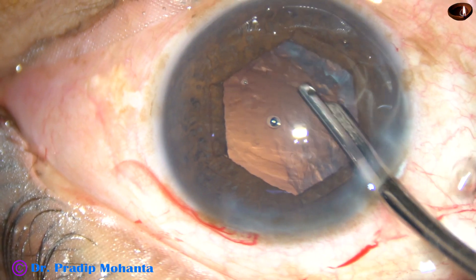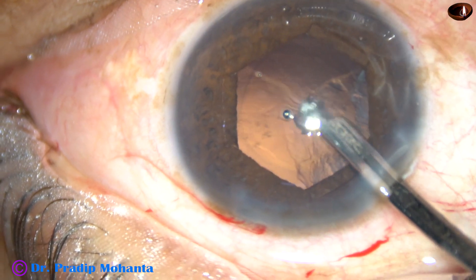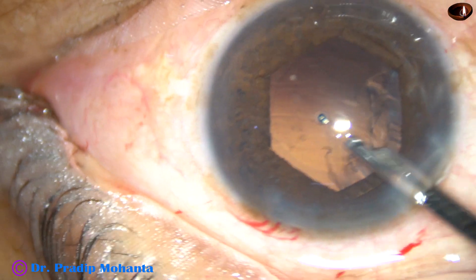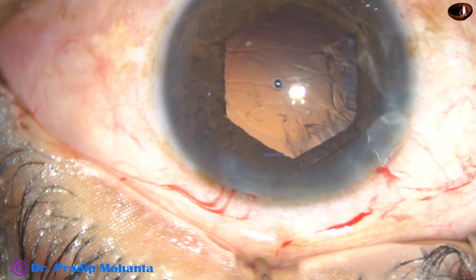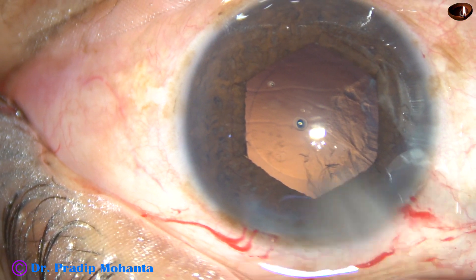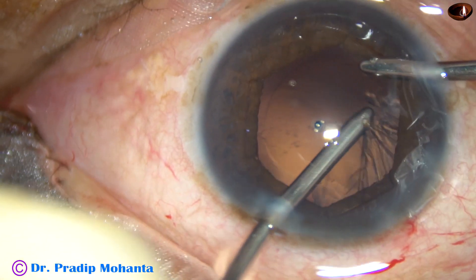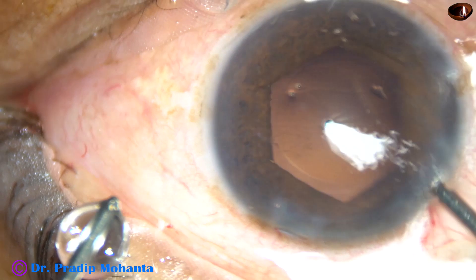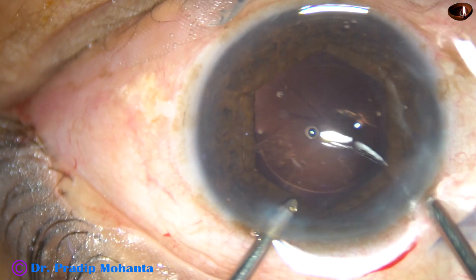Now I'm going to remove a portion of the cortex which is easily approachable by the Simcoe cannula. And now the sub-incisional cortex and the cortex at nine and eight o'clock are being removed by bimanual irrigation-aspiration. So you have seen that with this device you can use either Simcoe or bimanual, whatever you like. The cortical cleanup has been done.